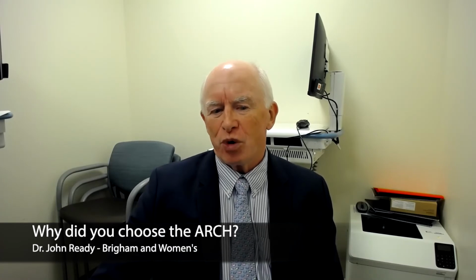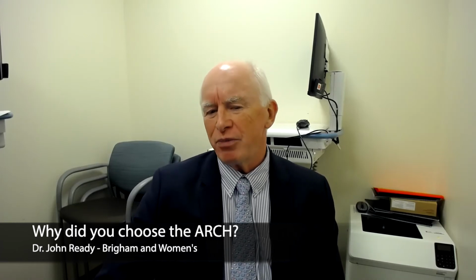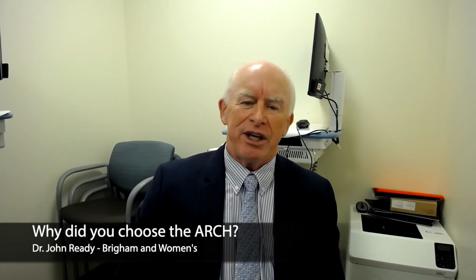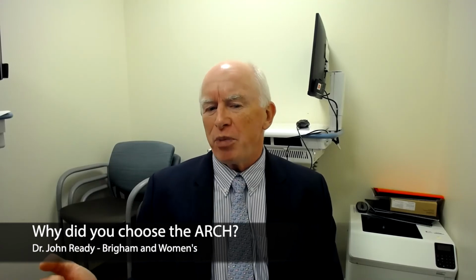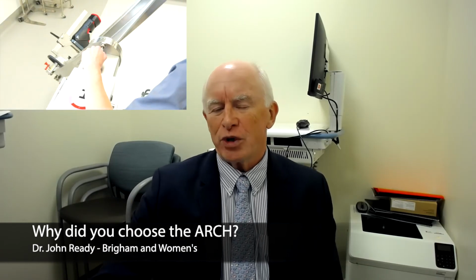But we found ourselves, when we're using the Hana, saying, oh, put it down. Yeah, can you just move it over a bit? Move it over a bit more. Okay, just twist it a little bit. And it often took a long time to get it in the position we wanted to do the operation. When we use the arch, we would say, can you just drop it down 2 clicks, rotate it 20 degrees, we'll pop it out, rotate 120 degrees, drop the table down to the floor, and adduct it over 40 degrees.